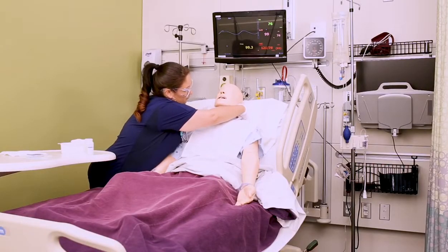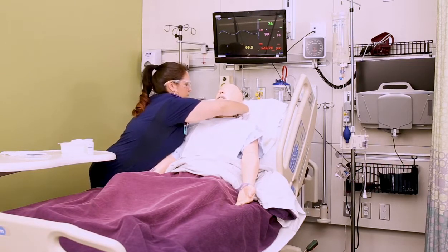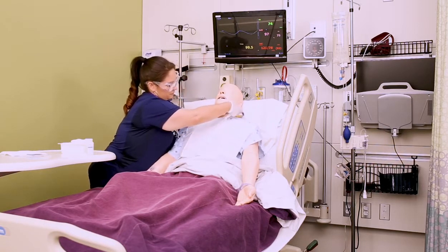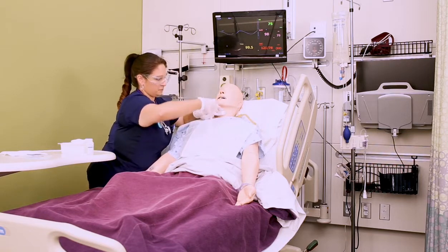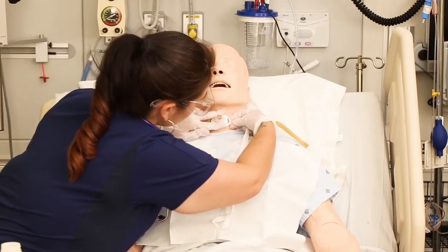Make sure your new ties are ready to go and within arm's reach. You will always want to keep one hand on the trach itself and start by untying one side of the existing ties. Now, if you have a Velcro tie holder like this, simply undo the Velcro and pull it out. Then you're going to insert the new ties through that one flange hole and secure it.